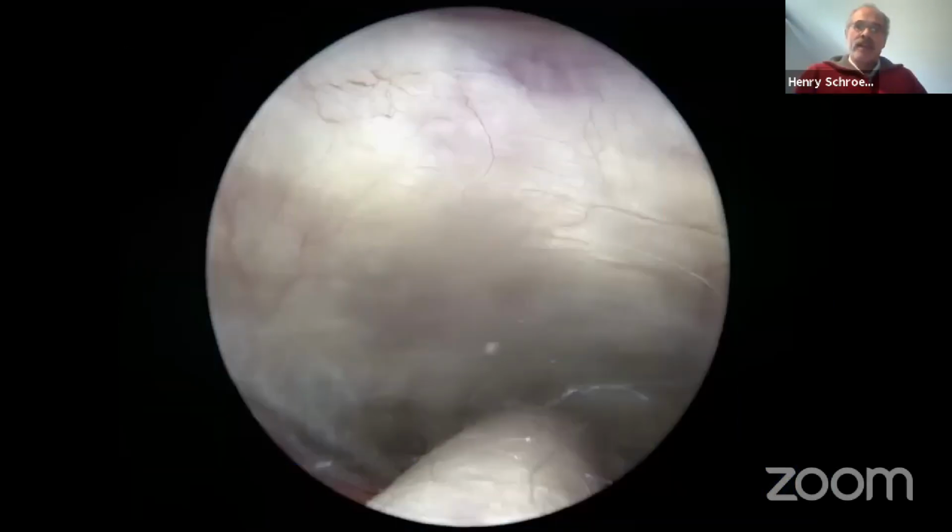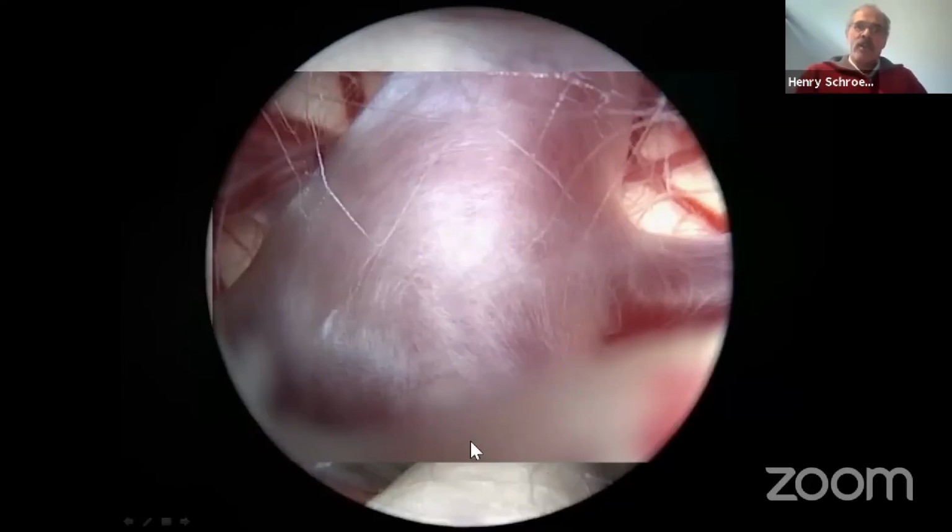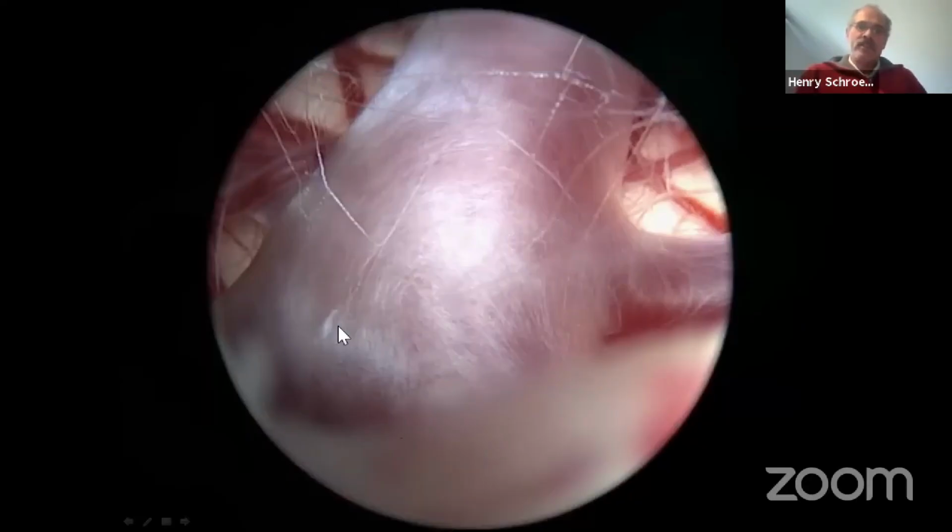Then we look with 30 degrees in the anterior direction. What we see is the clivus, diaphragma sellae, basilar artery. Then we look in the posterior direction. You see here the basilar, superior cerebellar artery, and here's one P1 and the other P1, and this is a bifurcation of the basilar. So this approach is much better for clipping of an aneurysm than your approach.